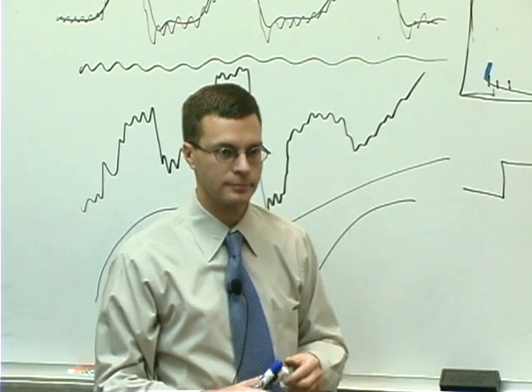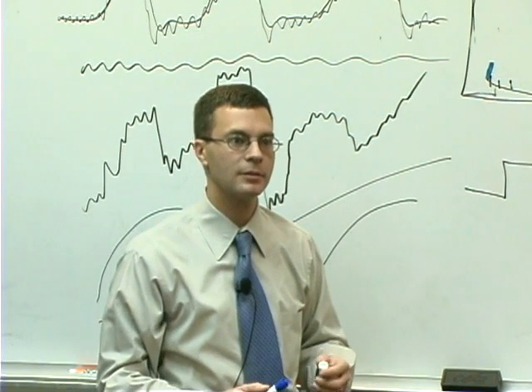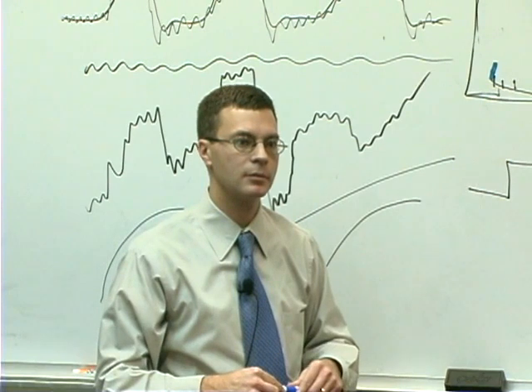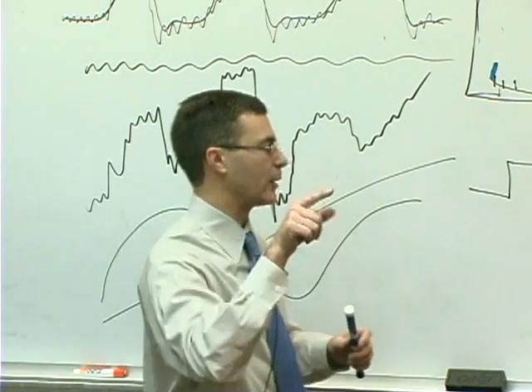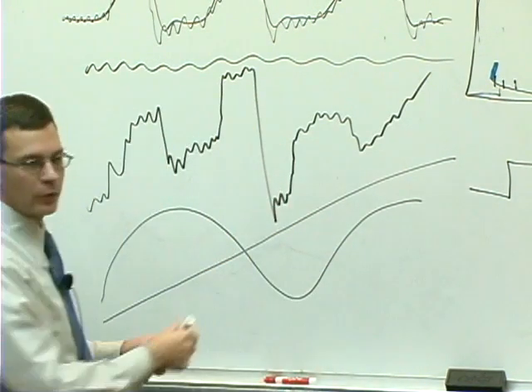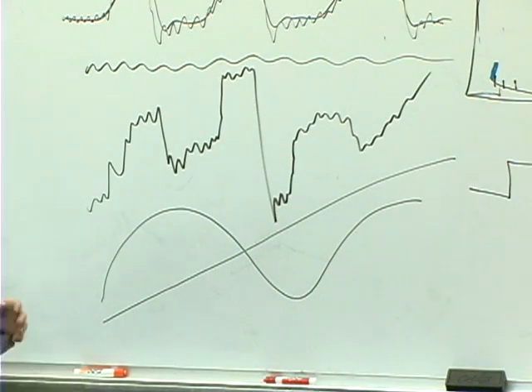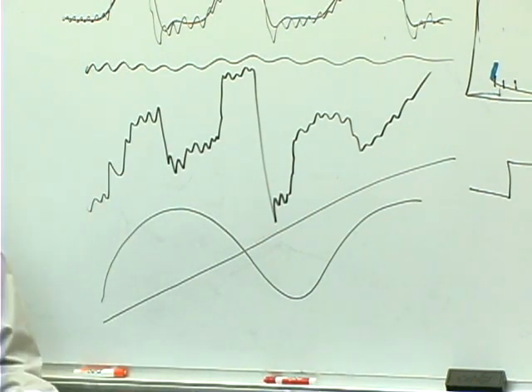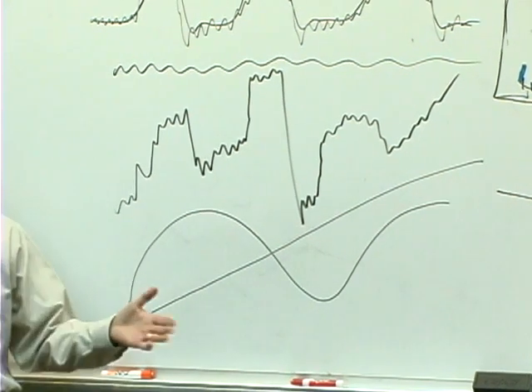Yeah? Oh, sorry. If you filter right up to the frequency of the test, aren't you making it see something? Great question. So the question was, wait a minute, if you're doing all this filtering, aren't you just going to mold the signal to look like what it is you want to see? And it's absolutely true. I could take any pattern of noise, and if I filter it enough, I will make it look like exactly what I want to find.